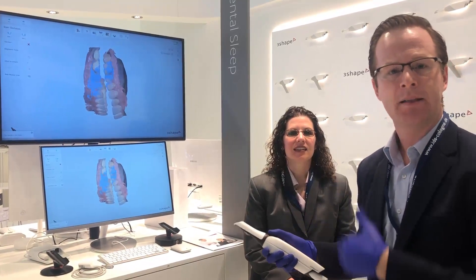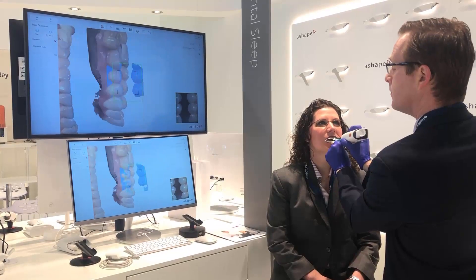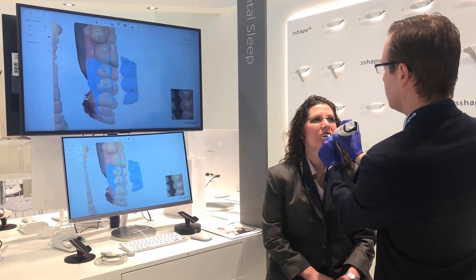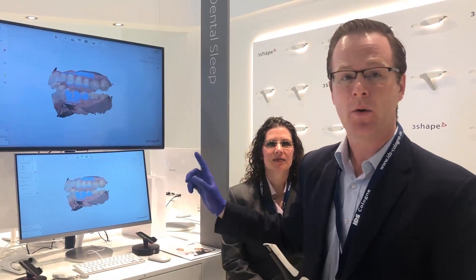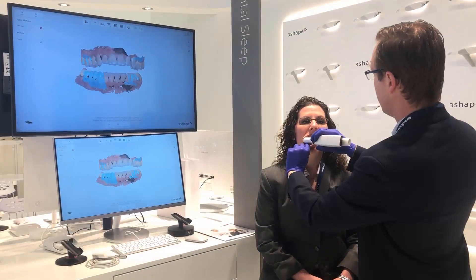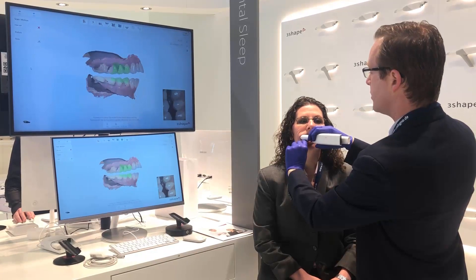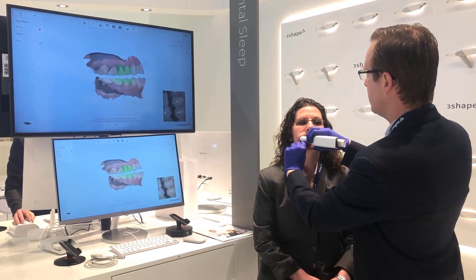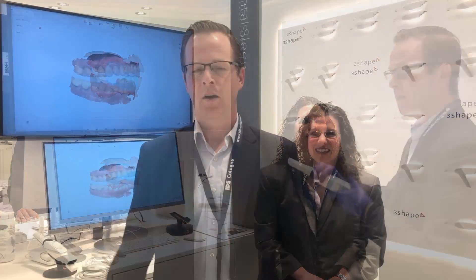We have our first bite captured. I'm going to bite and scan the bite on the opposite side. Now I've captured both bites. Let's go ahead into our patient-specific motion — side to side. We've gone ahead and scanned our patient using Trios 4.